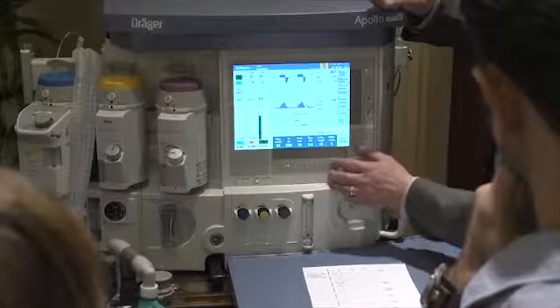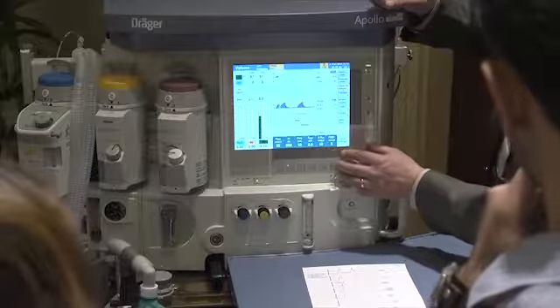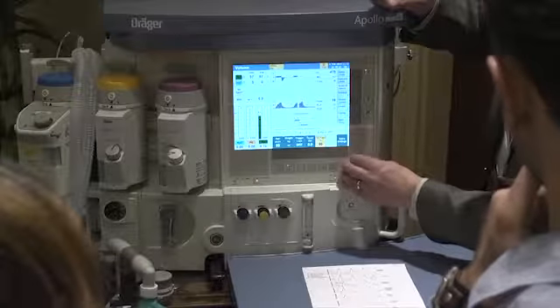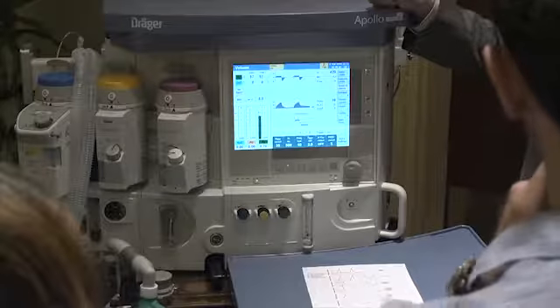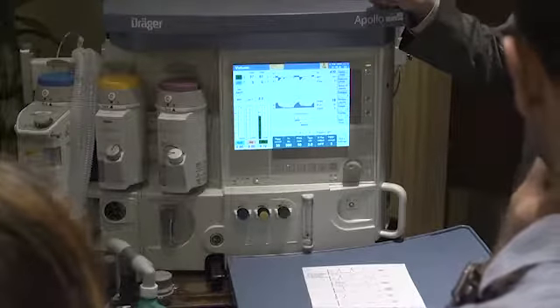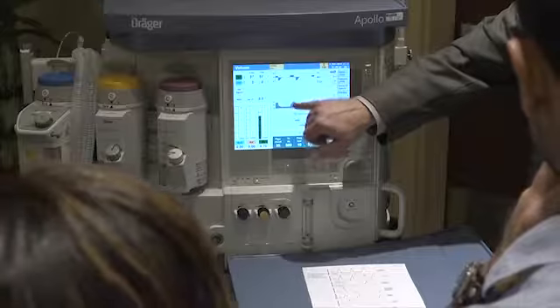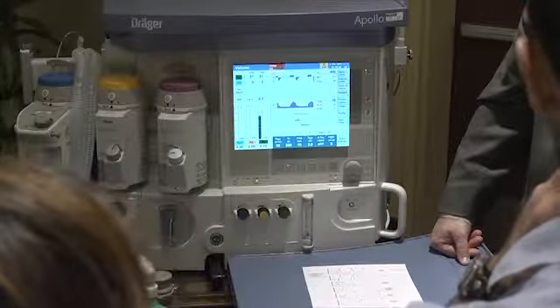So this is one of the keywords: different patterns of flow associated with different modes of ventilation. Most likely the question is going to present itself as a particular flow pattern that you would have to associate with a mode of ventilation. So we showed you volume control. This is volume control: the volume is the same breath per breath, but the inspiratory pressure might differ.